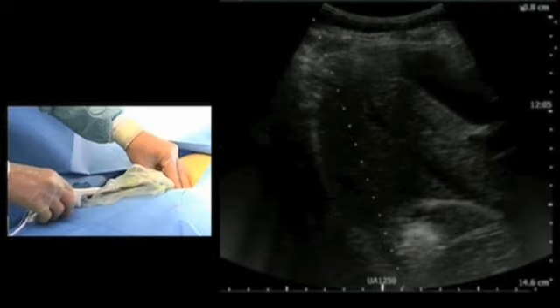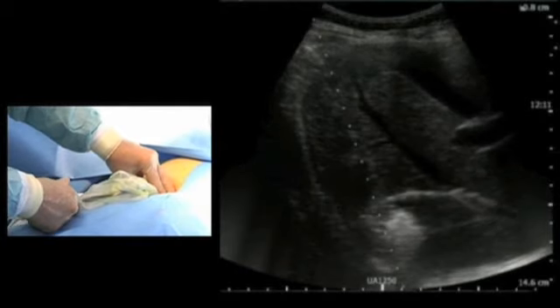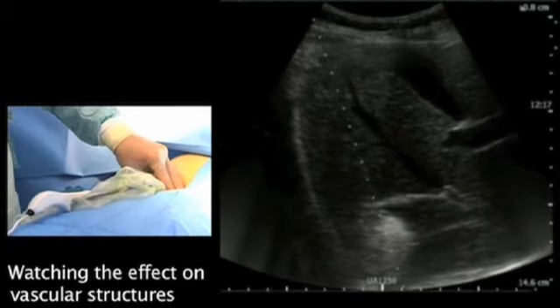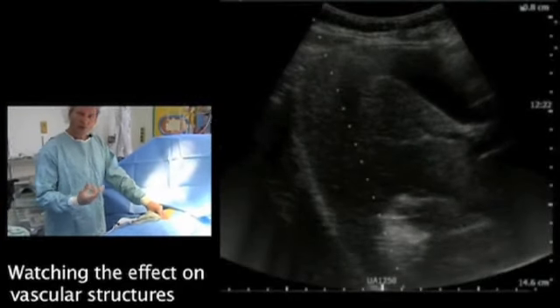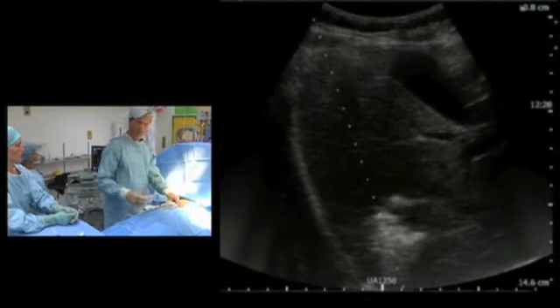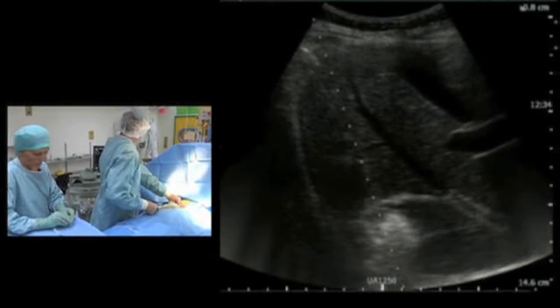Temperature has been reached, and then go to 4 centimeters. And again we see that we can move it. If you look at the ultrasound image, you can also see some white lines, and that is actually vascular structures with a lot of air bubbles, because we are frying or boiling some part of the liver, so small bubbles will be created and disappear throughout the vascular system. You can see it being drained into the right liver vein.